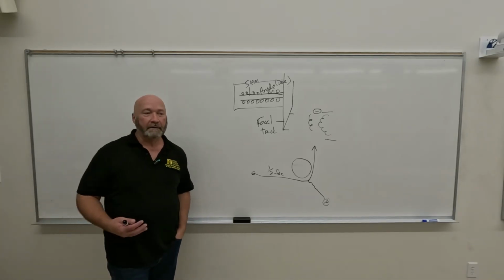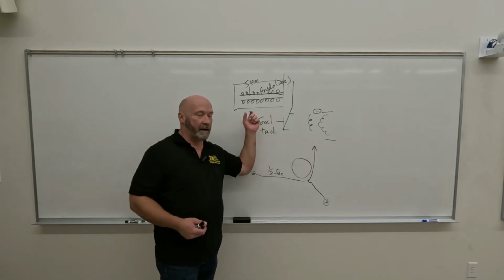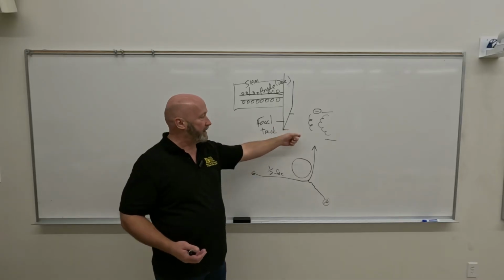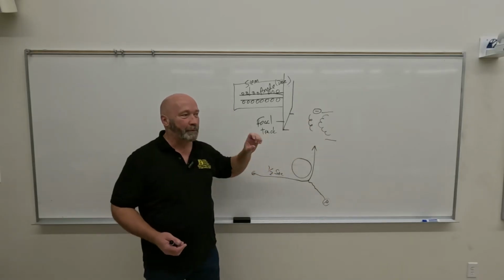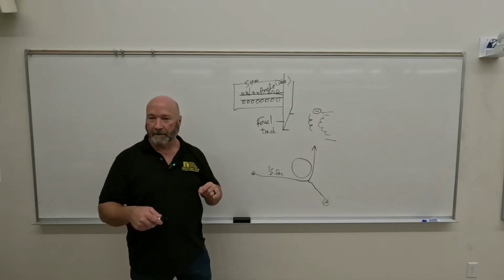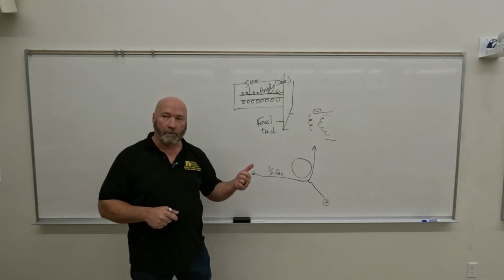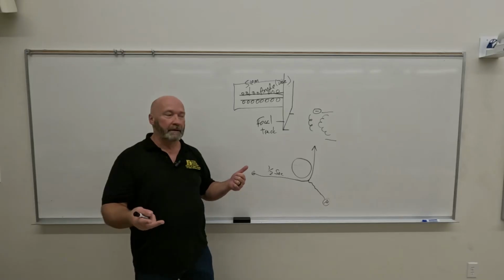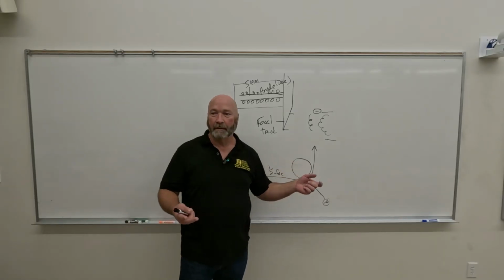No, it's going to last a long time. So we have to have a big nucleus, and we have to have a high melting point. And as he doesn't really mention, we have to have something that's not going to distort. But we can't put all that heat in one place, so we've got to be able to conduct it, right? So it gives us all four of those things. It doesn't warp, it doesn't melt easily, it conducts well, and what was the other one? Oh, yeah, high atomic number, right?